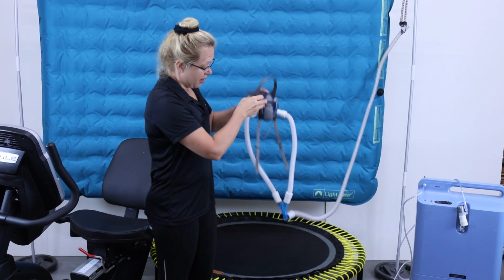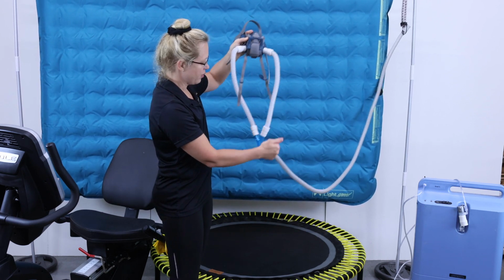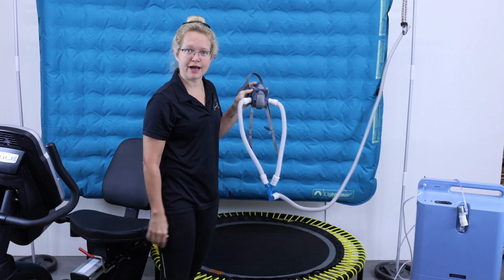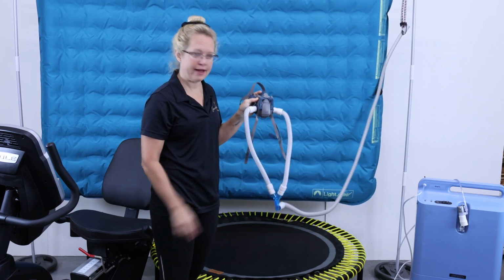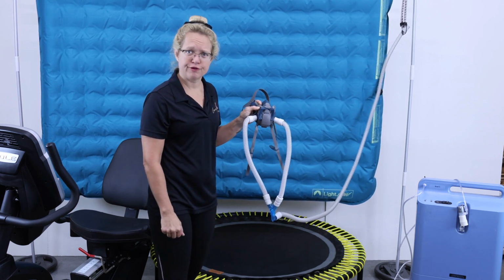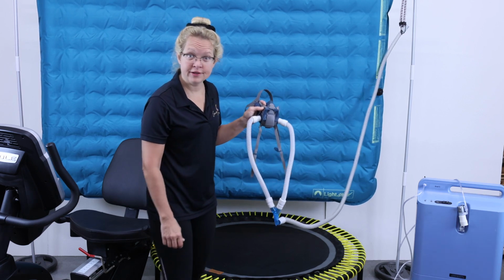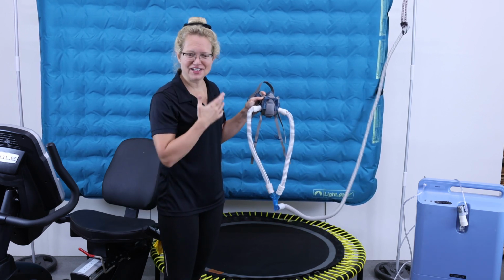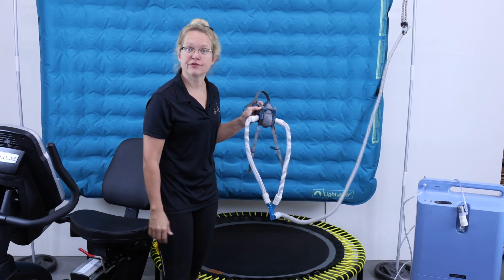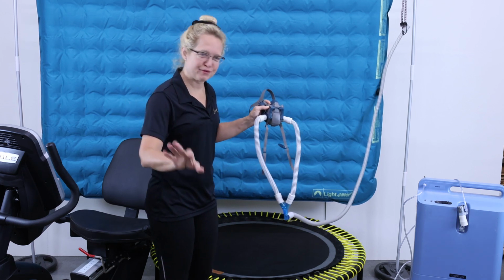And I ordered this Y valve right here, so that way I could breathe more oxygen faster while I'm exercising. So a lot of athletes get a dual hose mask. And dual hose masks are very expensive for EWOT systems. I've seen them run as high as $260. Well, this morning I looked to see what the latest price of the least expensive dual hose mask is: $110. So you can get them as low as $110, but I didn't even like that one for various reasons.